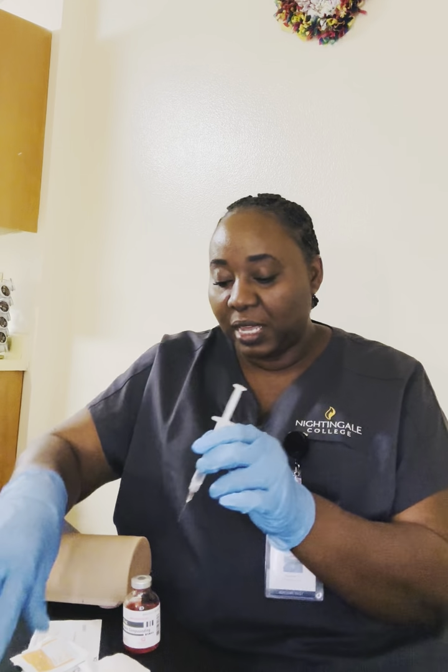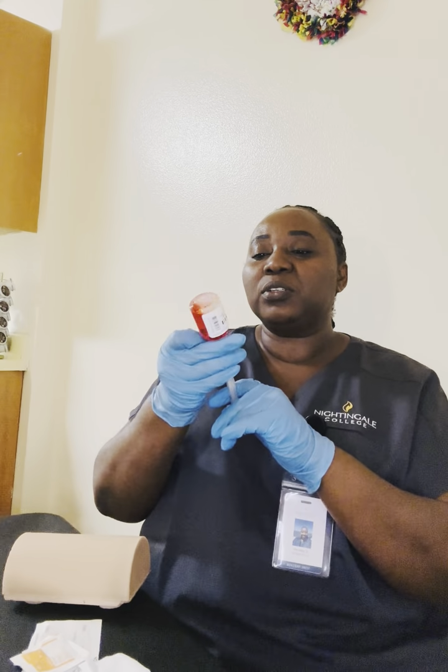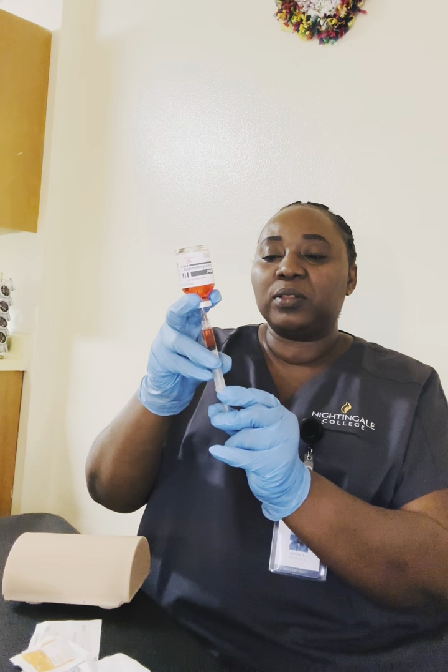I'm taking out 1.5 ml, so with the cap still on, I'm going to push 1.5 ml of air into the syringe. Take off the cap, put the needle over the top of the vial, push the air in, flip it over inverted, and then draw out 1.5 ml.